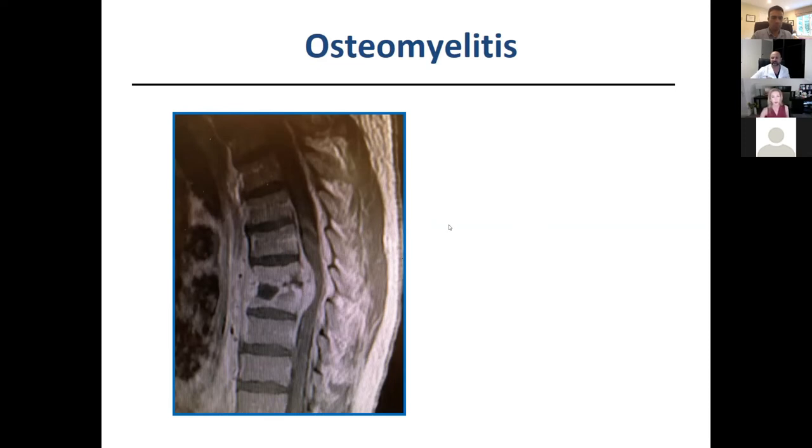Well, just from this one image, I don't see any central non-enhancement, so that would be phlegmon. You have to have central non-enhancement, like a real abscess, to call it an abscess. But for the degree of compression, no. I mean, that's what I've heard is the difference between conservative and surgical, but that degree of compression, I don't know that it matters. That is a lot for just a big phlegmon to be compressing the thoracic cord.